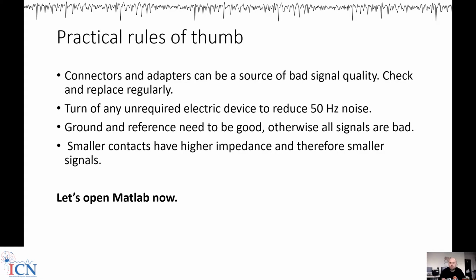Yes, it's possible to do that, and some people do it. I don't like it because it is a very unstable signal. It can disconnect, especially at the earlobe. There's a tendency for the electrode to drop or lose contact. Also, depending on the skin impedance, you can have variance in the actual impedance of the signal.